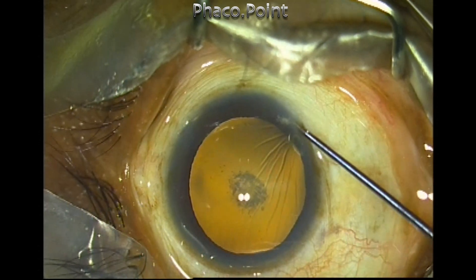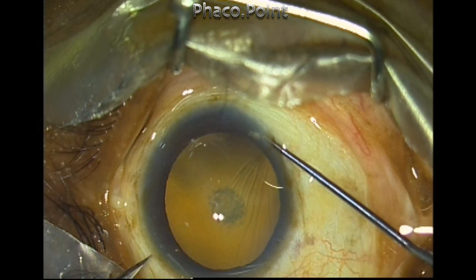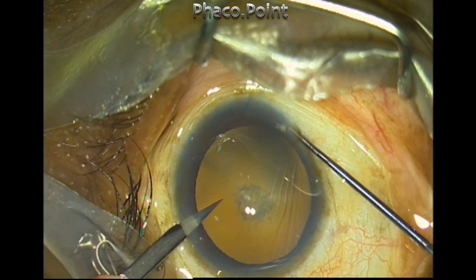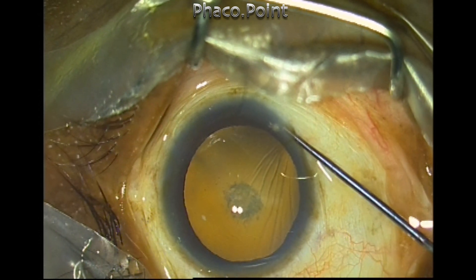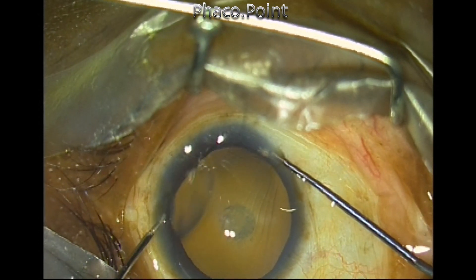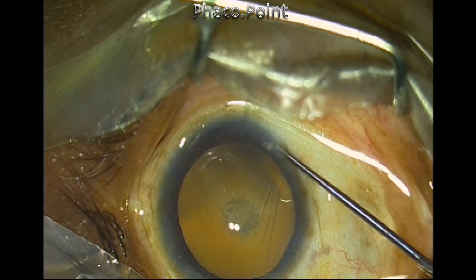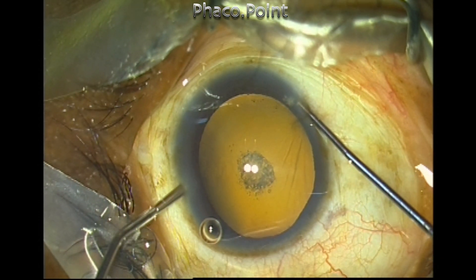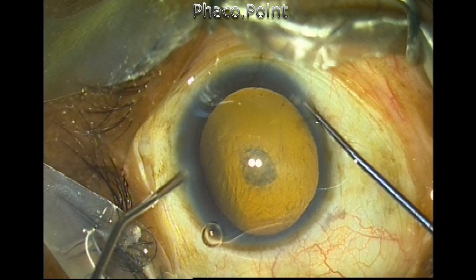The 7 o'clock position pocket is used to create the side port incision or assist in its creation. The 5 o'clock pocket is used to assist in the creation of the main incision. Once you hold this, the patient does not feel any pain, unlike any other method of trying to yank the eye into the visual axis.